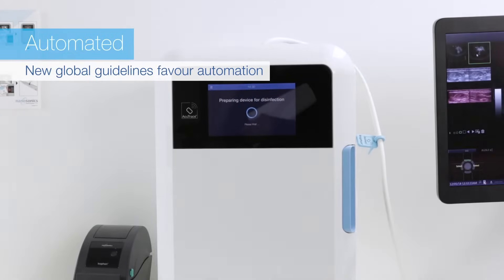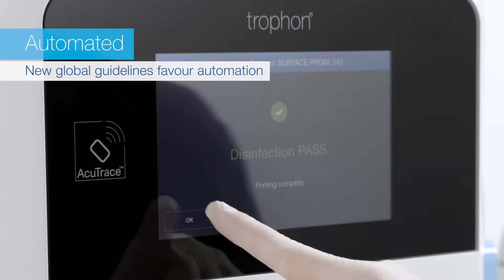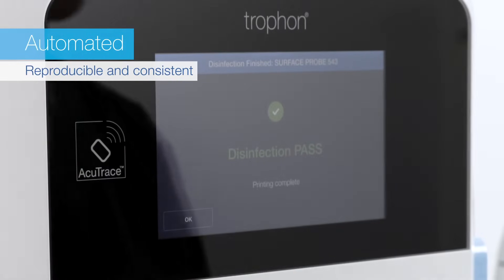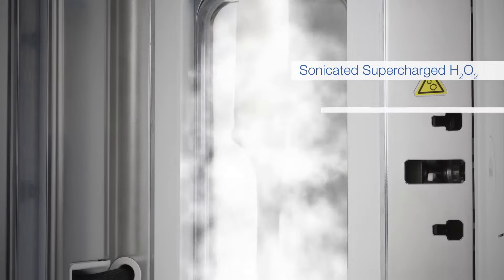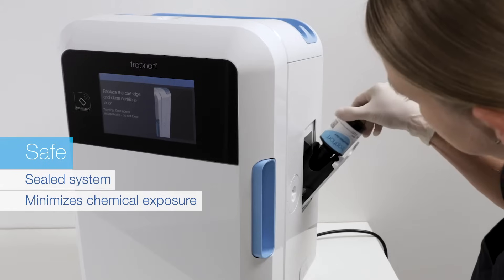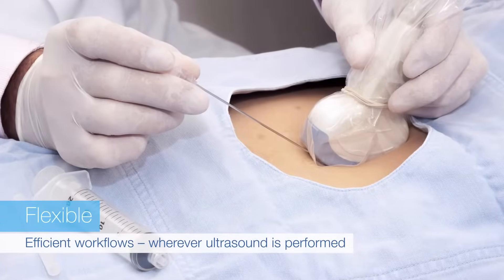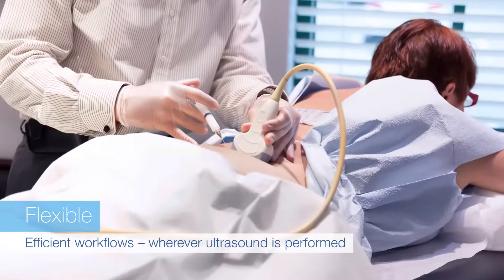New global guidelines favor automation over manual high-level disinfection, and you can be confident Trofon2 delivers reproducible and consistent high-level disinfection that is proven effective to protect patients, staff, and the environment. Trofon2 makes workflows efficient wherever ultrasound is performed.